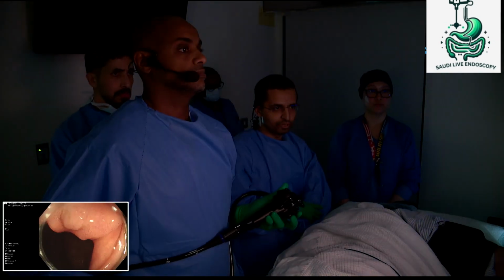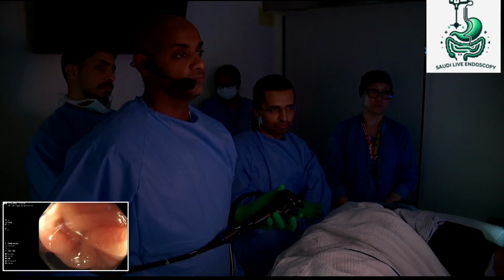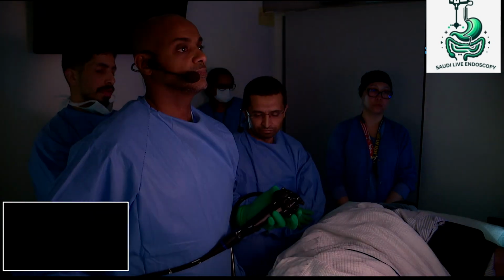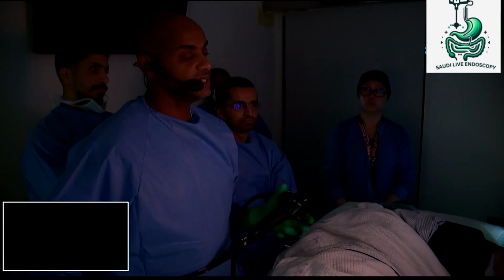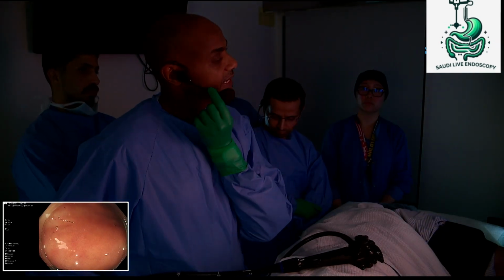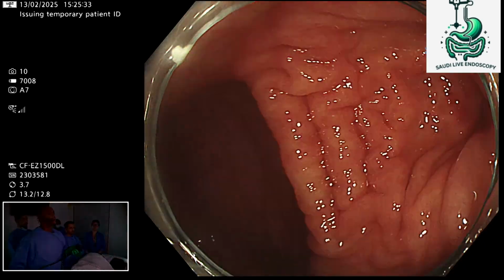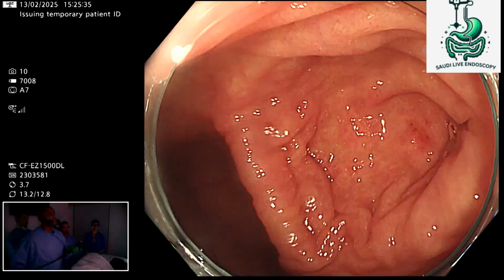Okay, so Dr. Ammar now will take us through optical assessment, and then we'll discuss what's the right strategy for resecting this lesion. Thank you. So as Majid said, can you hear me good now? Yeah, Dr. Ammar, very good. Okay, good. So this is quite an extensive lesion.